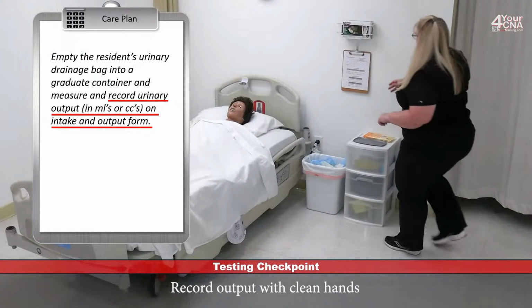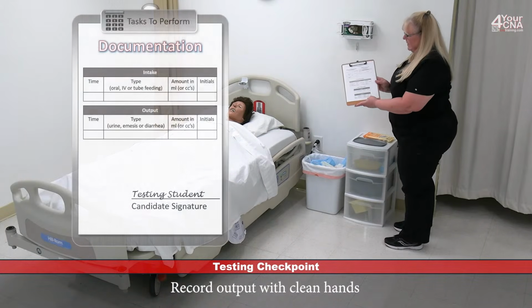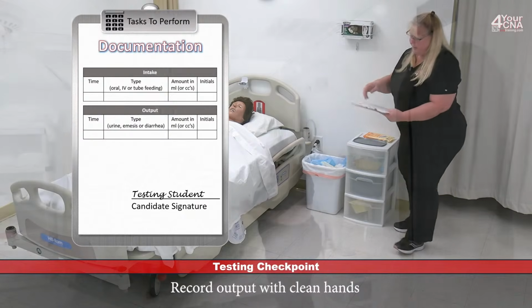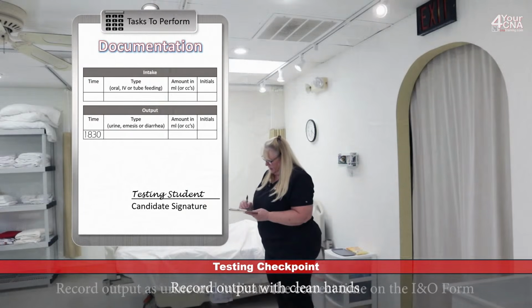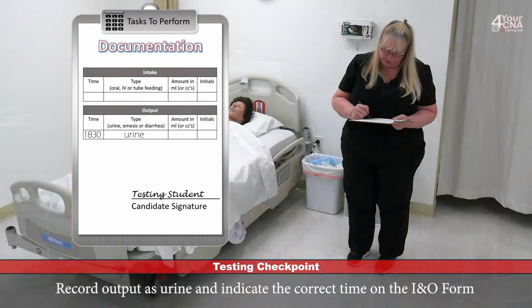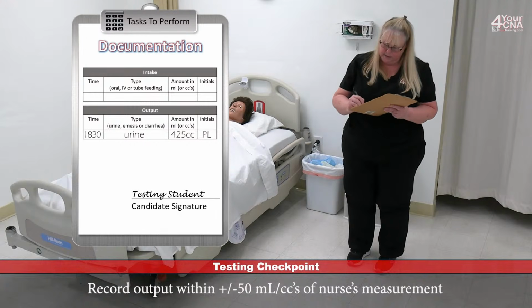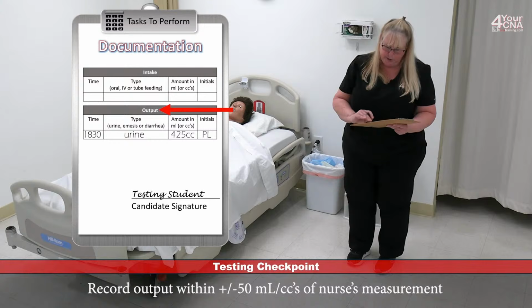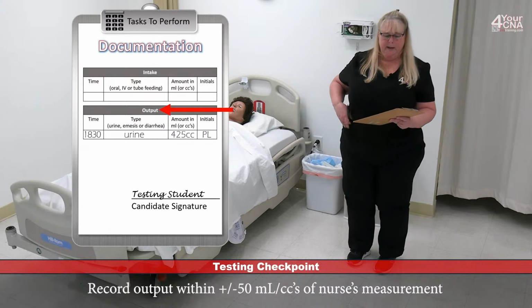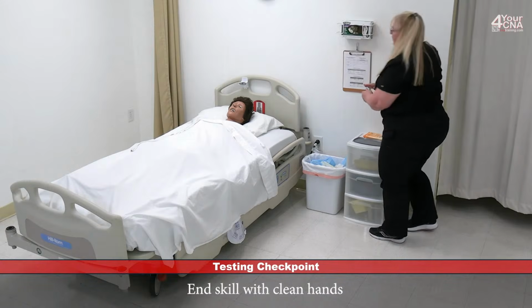After washing my hands, we'll document the amount of output on the documentation sheet provided by the evaluator. We're going to document the time of output, the type of output, which is urine, the amount of output in cc's, and my initials. And we want to make sure that we're documenting in the output section. After documenting, I'll wash my hands one final time.